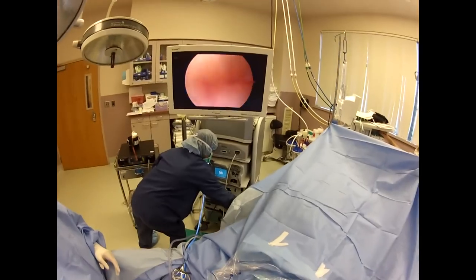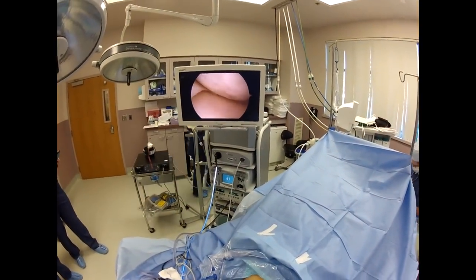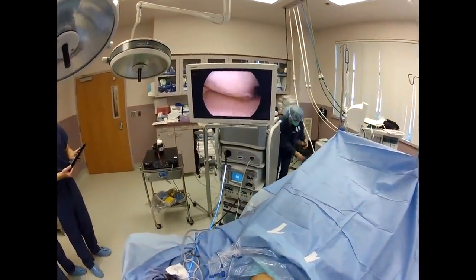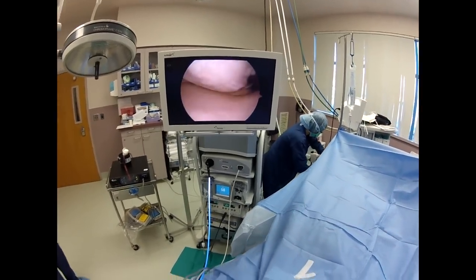As you can see, we get in here. We can see she has some chondromalacia right in there, and then you can see the tear right in there.